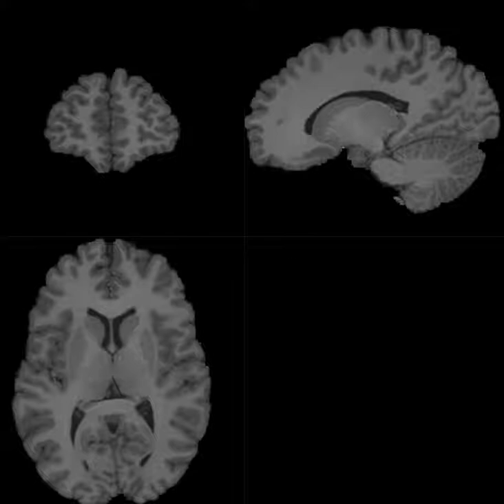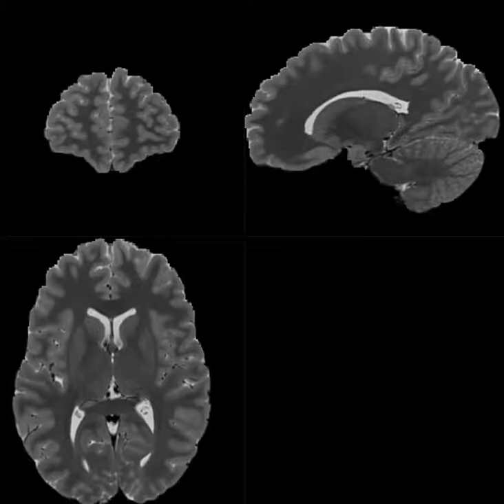If we go to our T2 weighted image, we can see that the contrast has now changed. And I'd like you to look in the center at the very bright white ventricles. And if you follow my cursor, it's right here or here. And we can see that there's much greater contrast now.